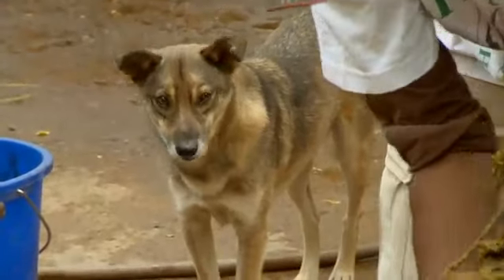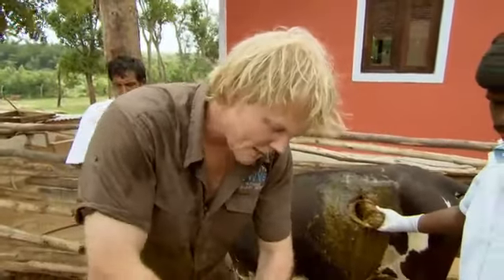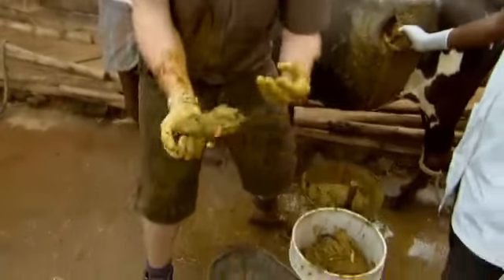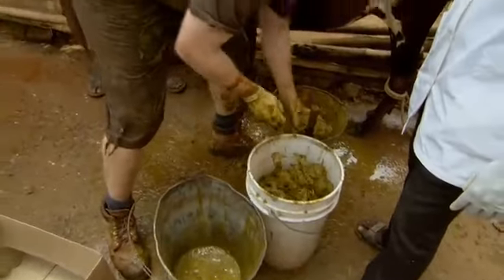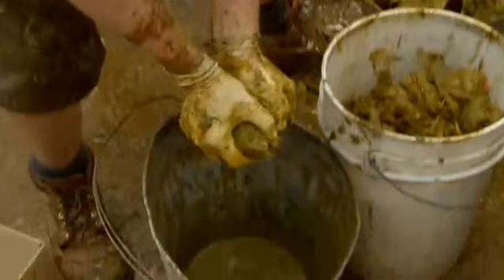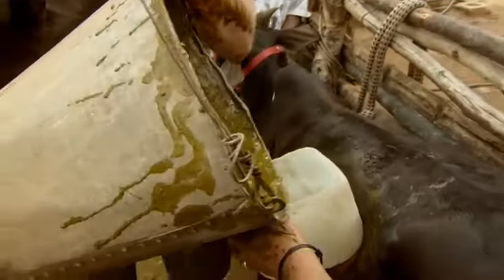Now, cows' stomachs, they depend on bacteria and a certain pH in order to work. So if I take all the contents out, the cow will go into shock and the stomach won't contract or work properly. Not that it's working very well at the moment, full of plastic. But the idea is that I'm going to wring this out and keep these important juices and these bacteria, and I'm actually going to put them back into the cow to kickstart its digestion. And these juices have to go back into the rumen now, and the rumen is a powerhouse for the cow, and it needs bacteria within it to work.